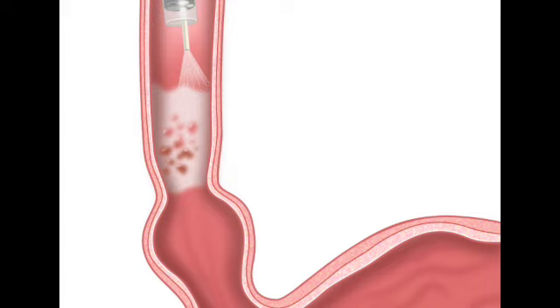That's pretty much it. Standard protocol often involves taking random biopsies at regular intervals and just hoping you sample the dysplastic tissue. That sounds so stressful. It is, but by applying the acetic acid, the doctor forces the tissue to create a dynamic visual map. That is so cool. The loss of aceto-whitening highlights the exact coordinates of the danger zones. It allows the doctor to target their biopsies directly to those rapidly fading areas. So it turns a blind, hopeful search into a targeted precision strike. Perfectly said. It forces the invisible danger to basically announce itself. Yes. That makes total sense for a narrow space like the esophagus. Yeah. You paint the tunnel, you watch for the fading spots.